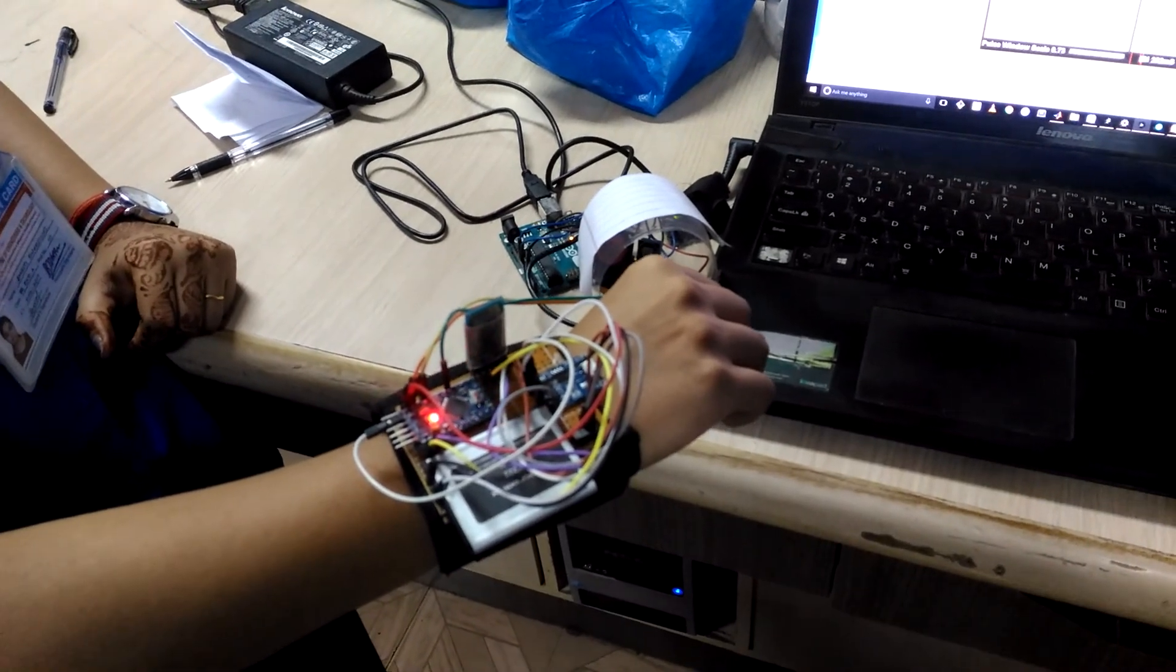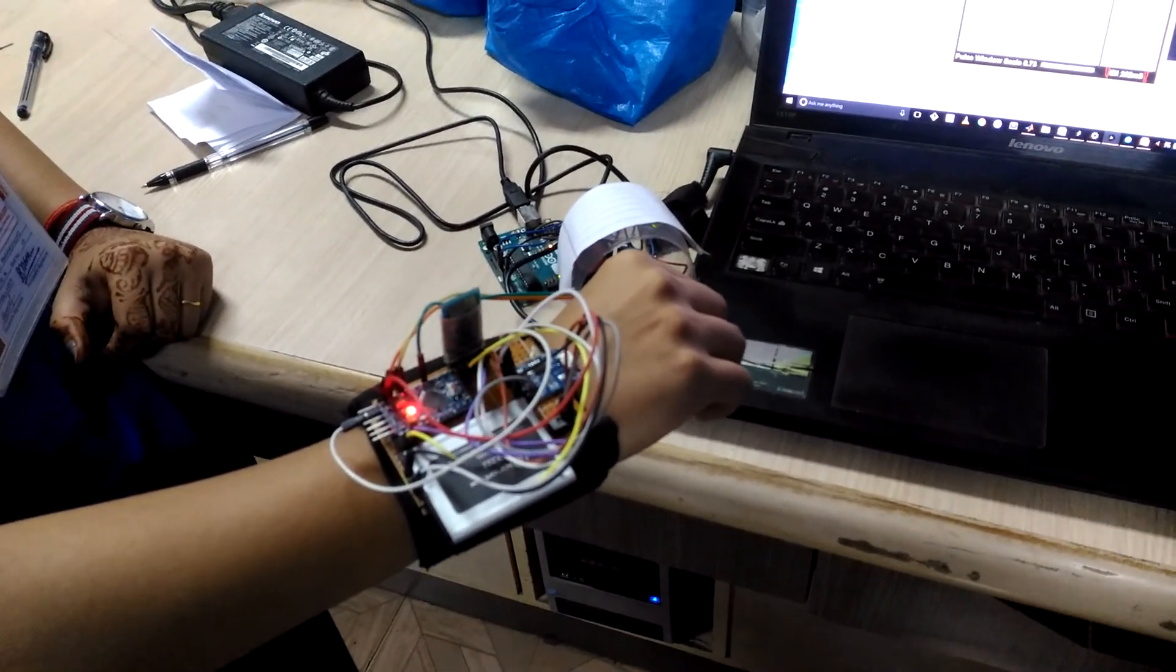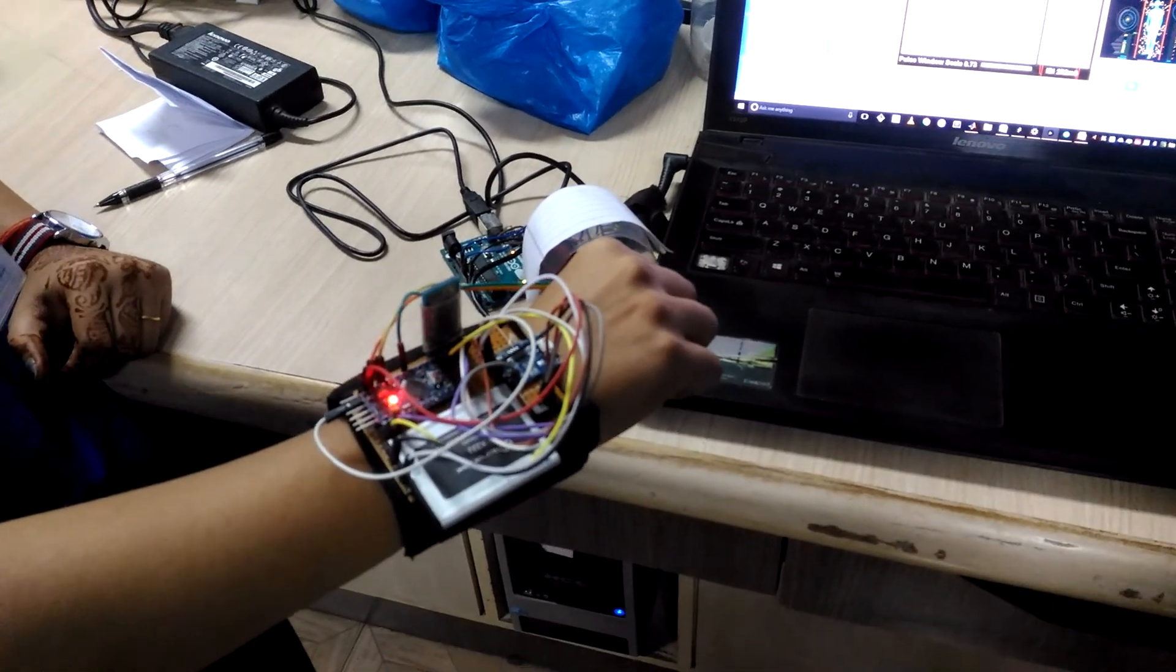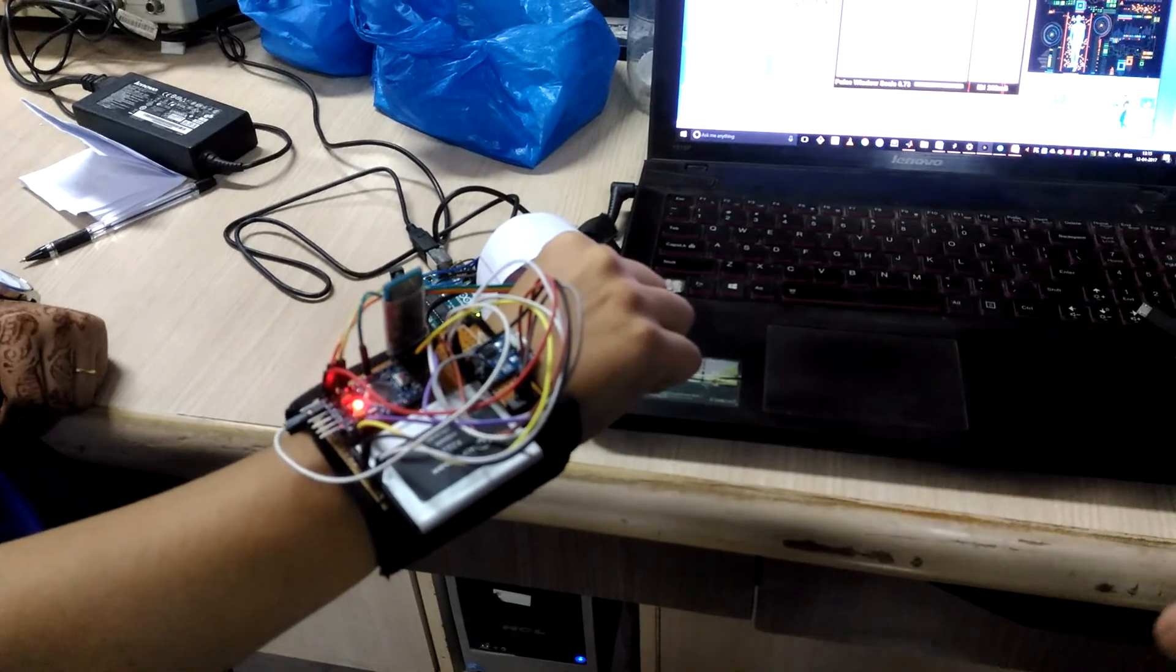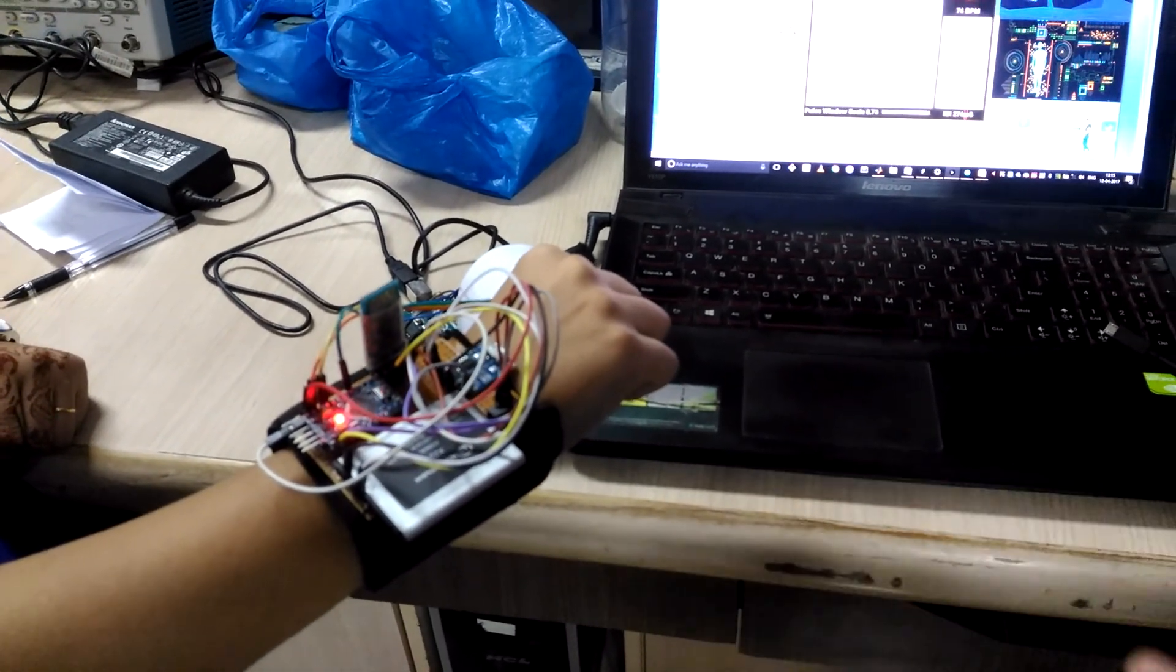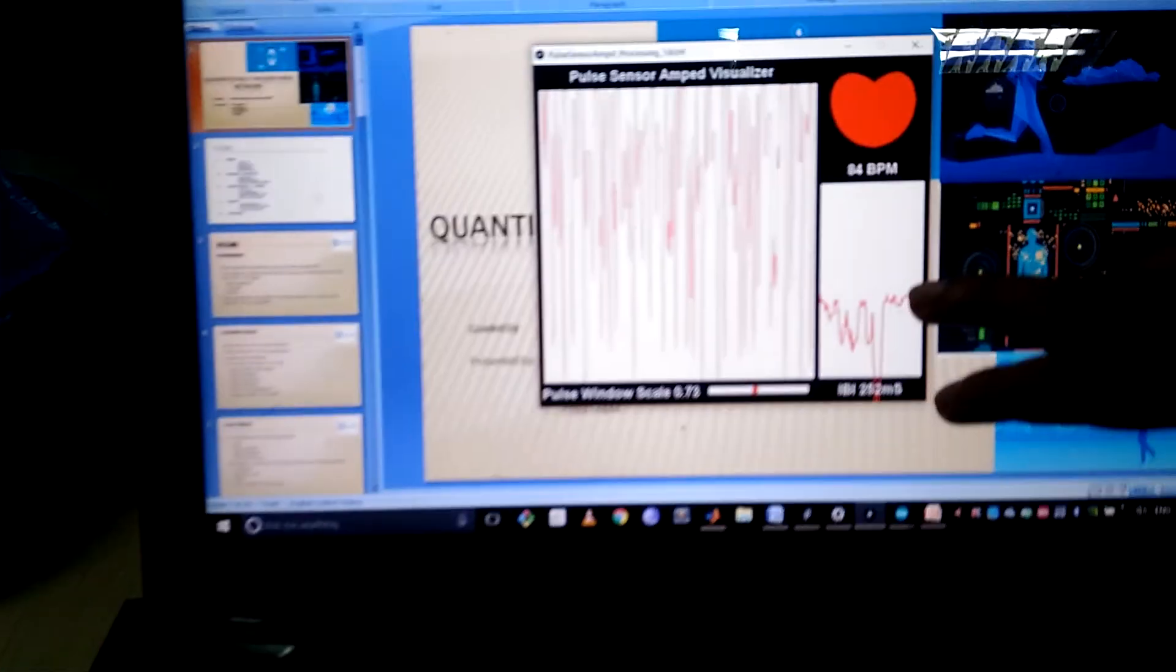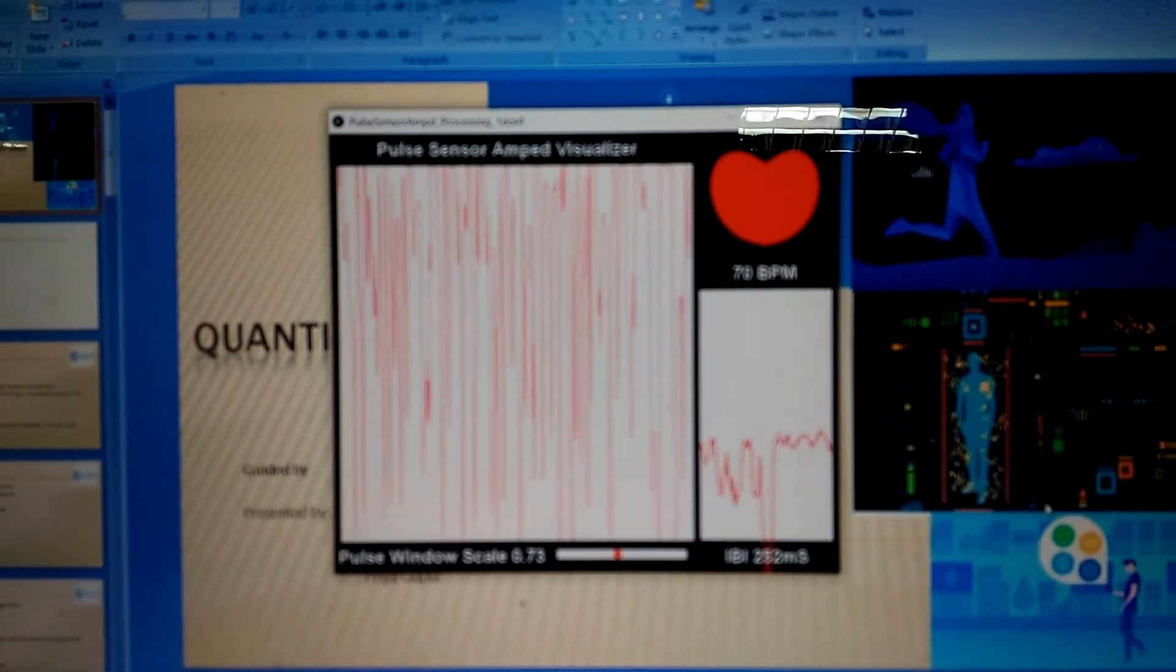The first part of the project is a health tracking band to monitor parameters like heart rate and temperature. Right now we are showing how heart rate is measured and the data is transferred to the PC as a base unit via the Bluetooth module. We can see the output right here where the heart rate is being constantly monitored.